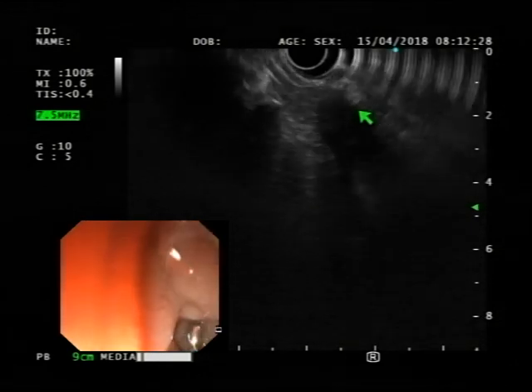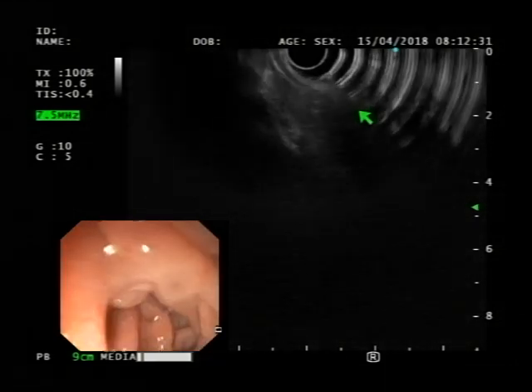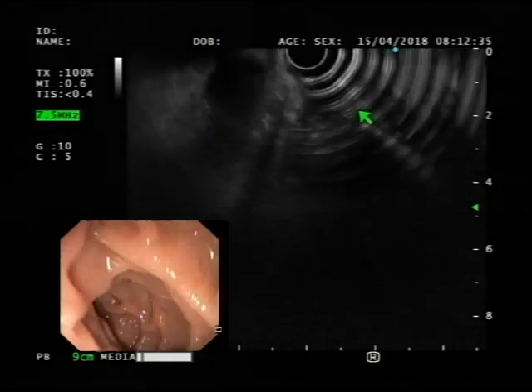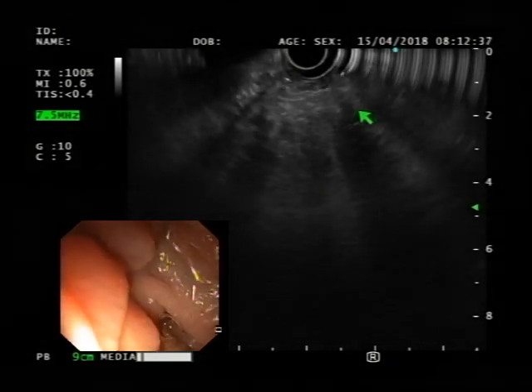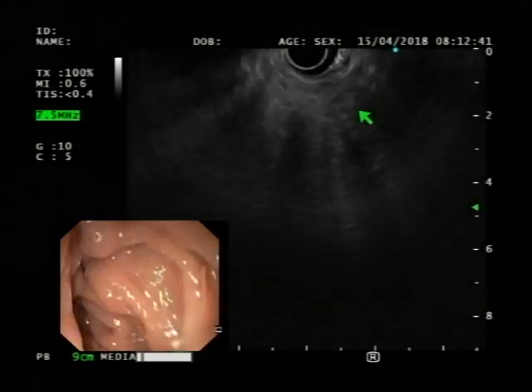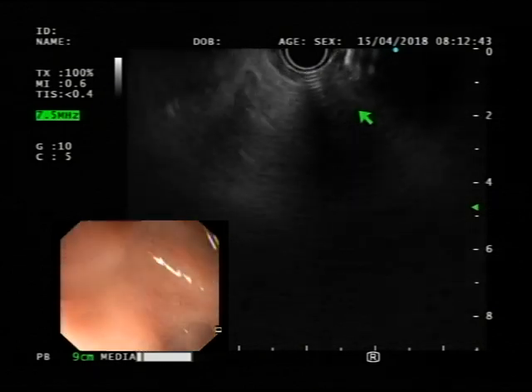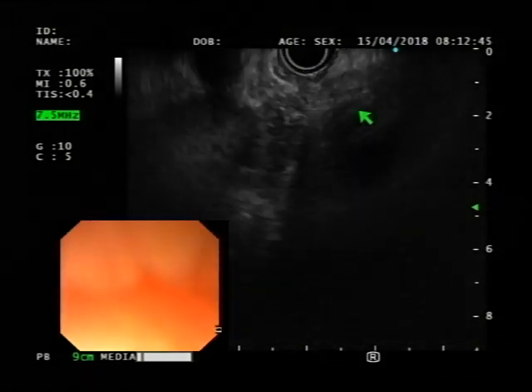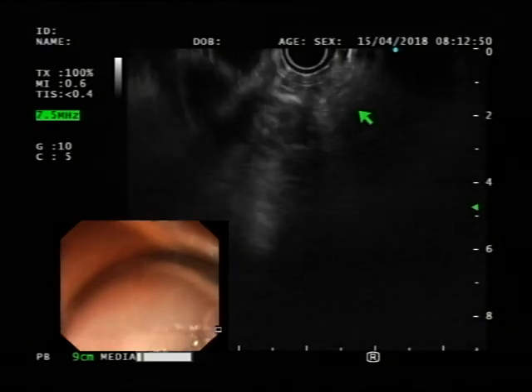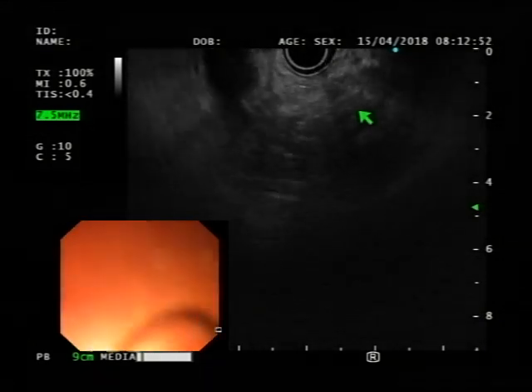Endoscopically. Good. Keep going, keep going. Okay. Big wheel towards you. Okay. Good, good. Okay. So, yeah, sir. Now reduce the scope. You don't need to do so much that you have to hang upside down. So just small wheel away from you. You can lock it until you reduce the scope.